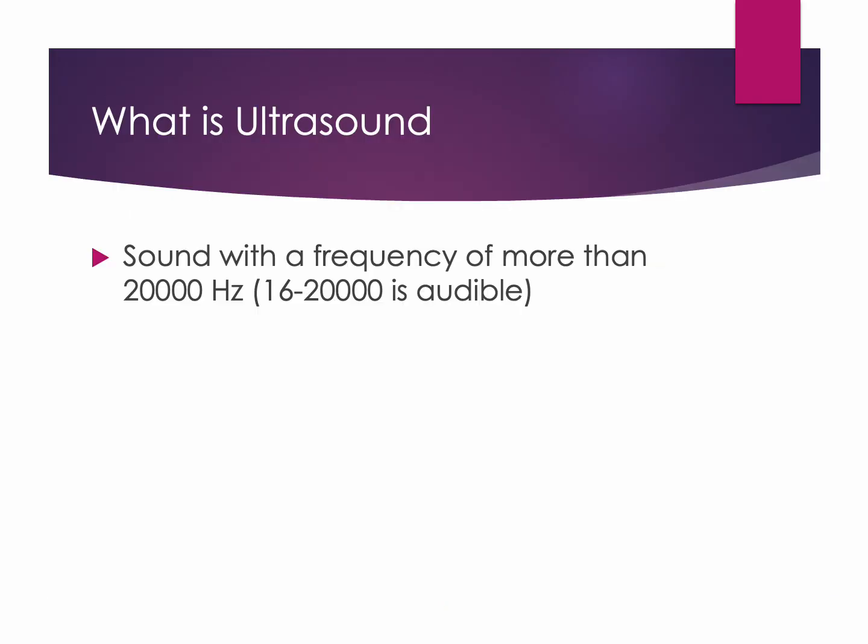Ultrasound is a type of sound wave, specifically a compression and rarefaction wave. What makes it unique is its frequency. Anything above 20,000 hertz is considered ultrasound, which means it's not audible to the human ear. Clinically, we use these high frequency waves to interact with tissues in a therapeutic way.